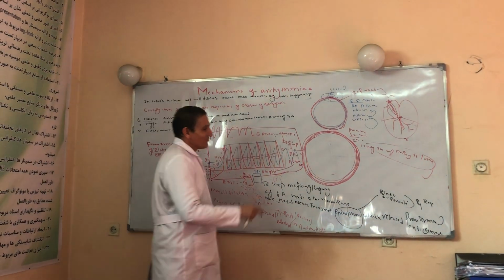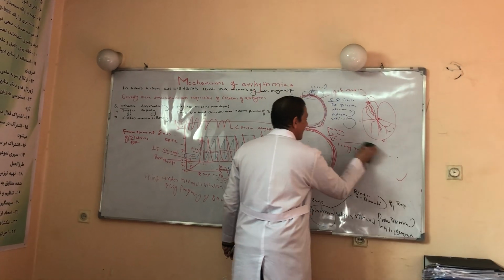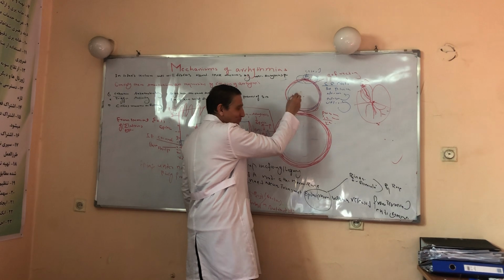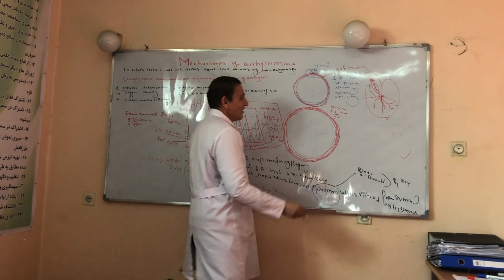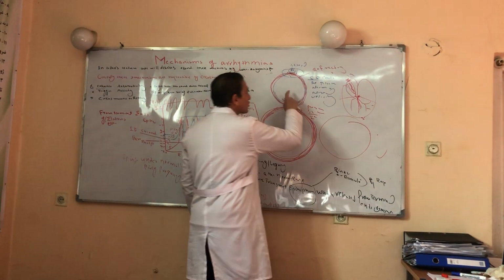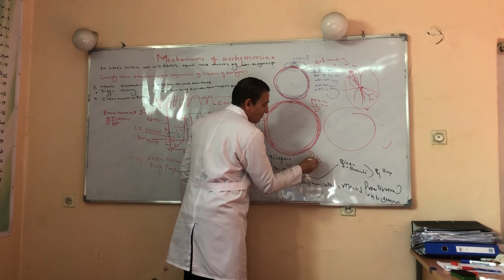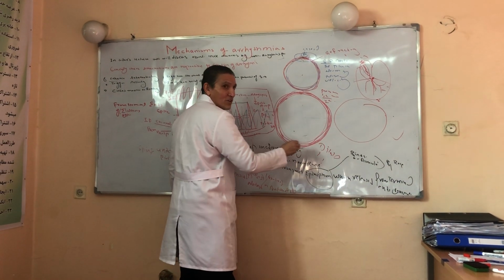Okay, the second experience. In this second experience, this time, this was a normal condition. This was abnormal: the length of the pathway is longer. The most common case of this is when the pathway is lengthened, in people who have developed a dilated heart. In a dilated heart, this strip is also longer.